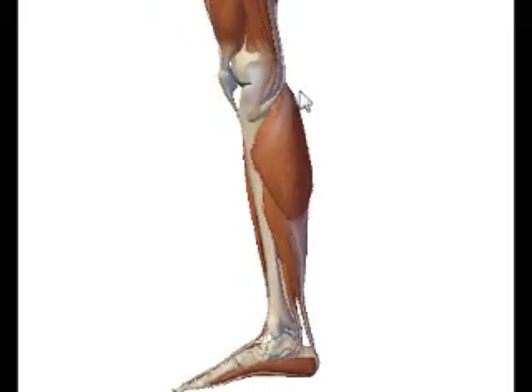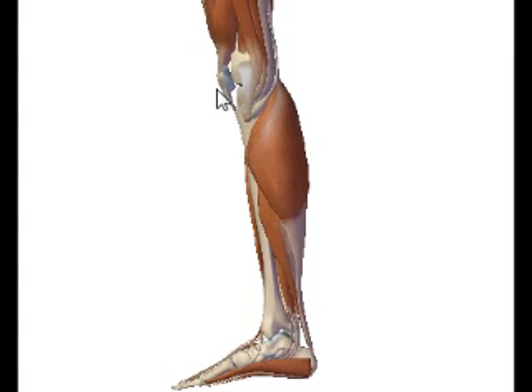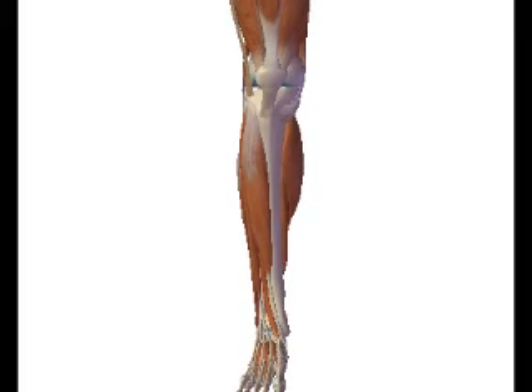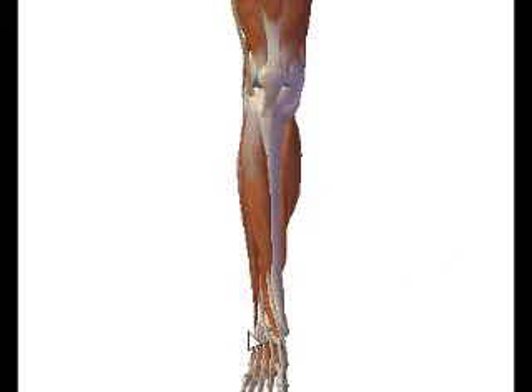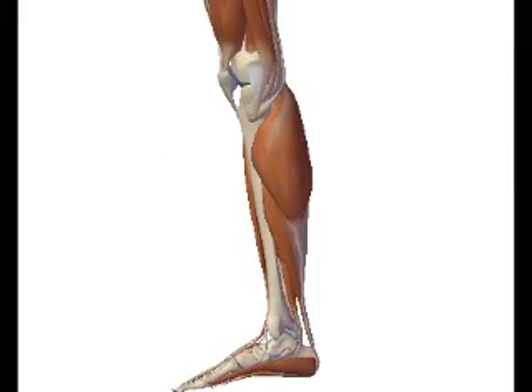As far as your rotation, you can also feel the patella — both sides of the patella pretty easily. Palpate those on just about anybody. Feel those and make the line between the medial side and the lateral side of the patella perpendicular to the IR. Also, before you start, use the foot as a positioning guide — make the foot point parallel to the IR, and that'll pretty much put you directly in a lateral position.